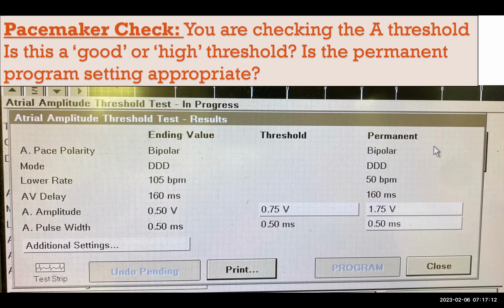These types of changes, lowering it down, particularly for the ventricular lead in a person who is pacemaker dependent, can literally add 3 to 5 years of longevity to a pacemaker, depending on how much the patient uses it and what their threshold is. So it's quite important to make these assessments, particularly for pediatric patients who are going to need lifelong pacing. It's one thing if you're putting a pacemaker in an 87-year-old person, where if you got 10 years out of it or 6 years out of it, you might be reasonably pleased with that result.